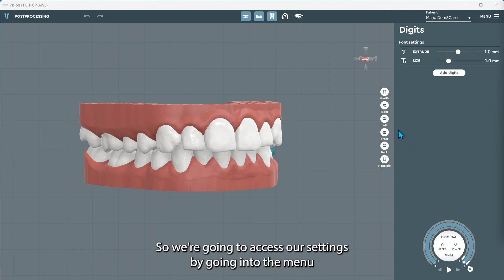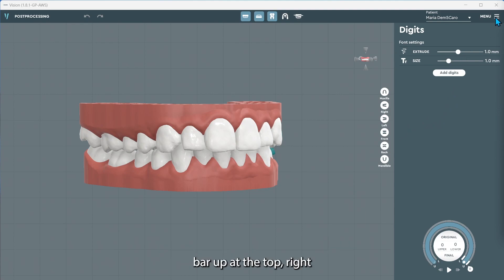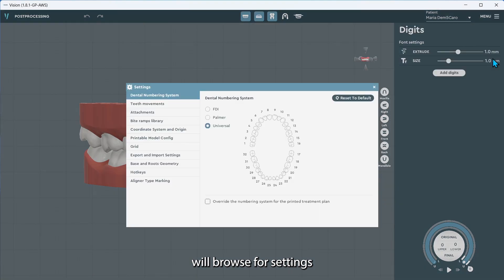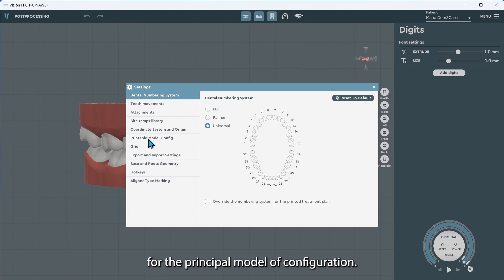We're going to access our settings by going into the menu bar up at the top right. We'll browse for settings and we're going to look for the printable model configuration.